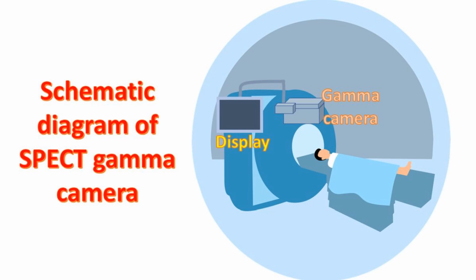A radioactive tracer like technetium-99m sestamibi is injected into a vein, and a nuclear scan using a gamma camera is obtained after about 20 minutes. This will show the amount of radioactive tracer in each part of the myocardium at rest.